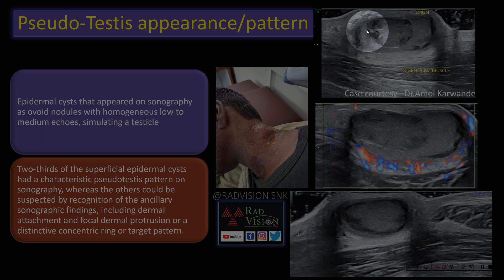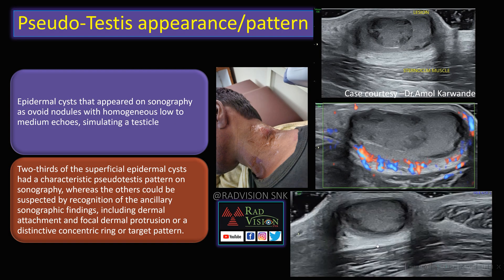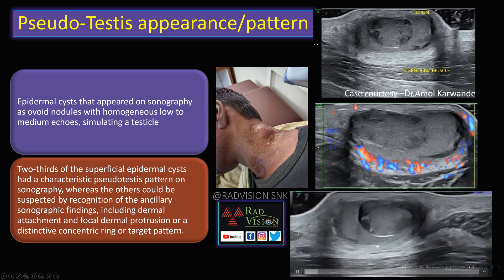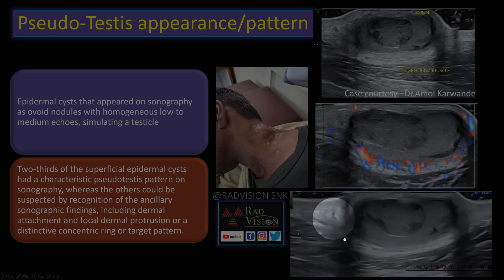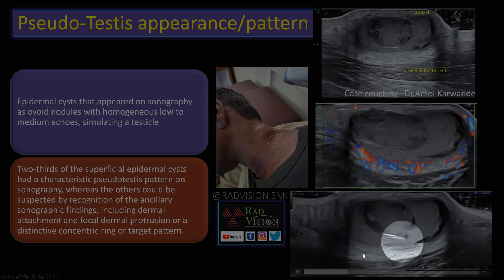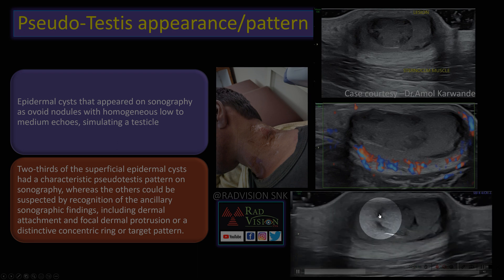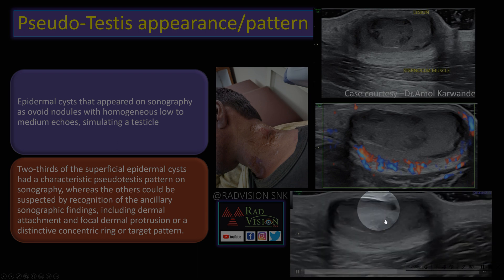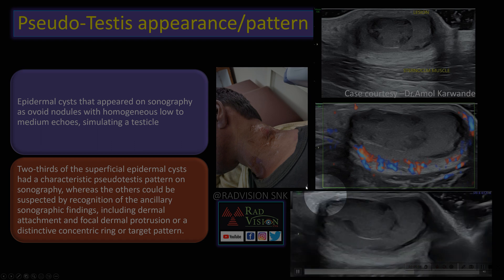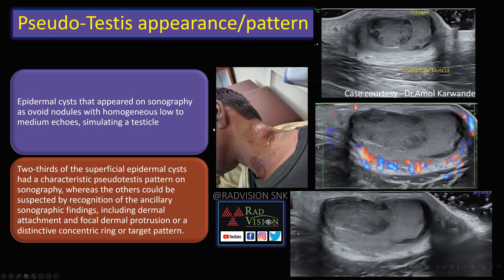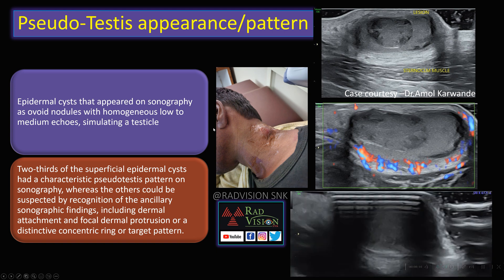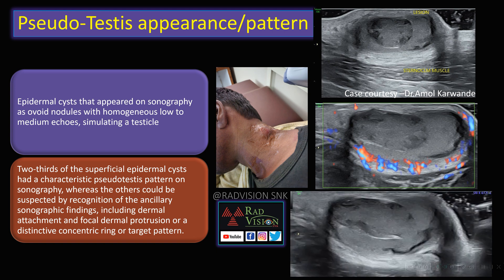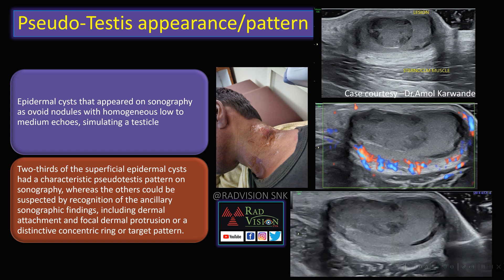This imaging echo appearance mimics a testicle, which is why it is called the pseudo testis appearance. Playing the video of this case, you can see a testicular-like structure noted in the sternocleidomastoid muscle with a central hypoechoic area and an echogenic area also showing a target pattern. Whenever you see this pseudo testis appearance or pattern, definitely suspect an epidermal cyst.